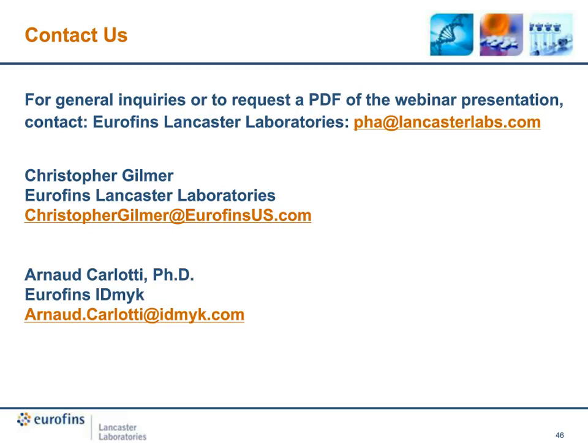This one's for Dr. Carlotti. Can your ID system identify Bacillus anthracis? Is it in your system database? Yes, it's very difficult to identify this species as compared to the Bacillus cereus group using only 16S. By using multi-locus sequence analysis, we can reliably discriminate this species, anthracis, from the other members of the Bacillus cereus group. So the answer is yes, by using multi-locus sequence analysis.